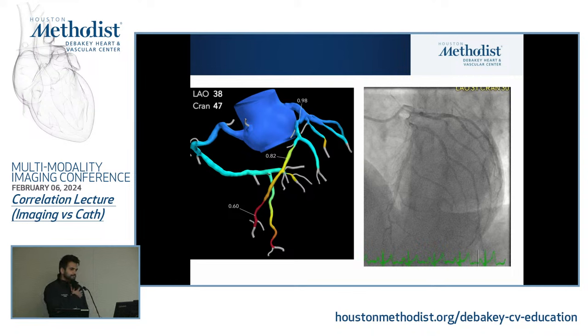So how would you do it? Okay, so they didn't do an IFR. Their reasoning behind this is that they saw these lesions, not necessarily the CT being positive, they saw the lesions, they saw he's diabetic, and his ejection fraction is mildly on the lower end. They're like, okay, let's not put a stent in, let's take a step back, talk to the patient, get the primary cardiologist involved, and make the best decision for the patient. So this is what ended up happening outside of the cath lab.